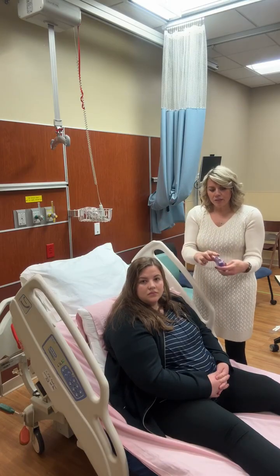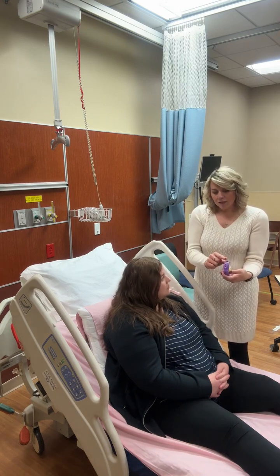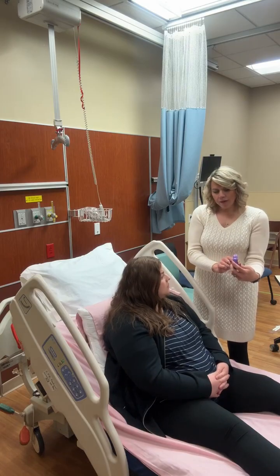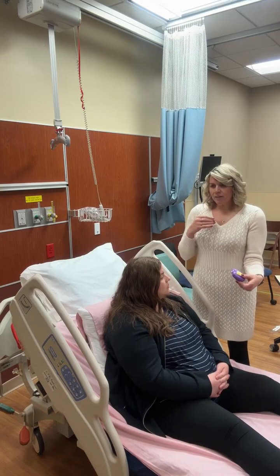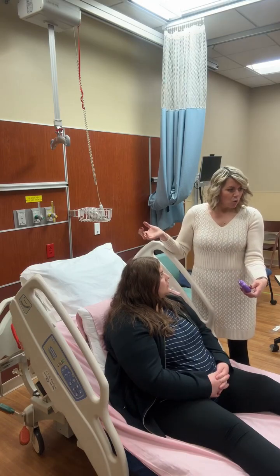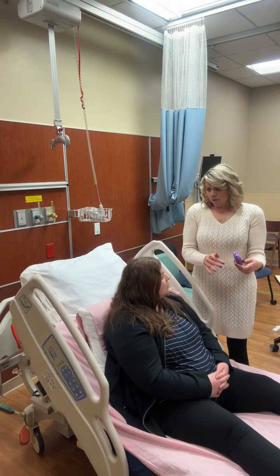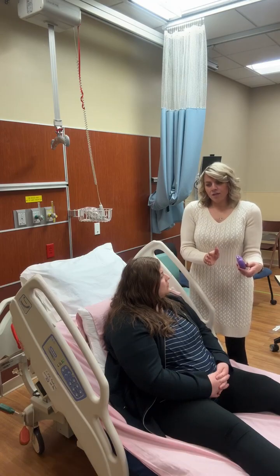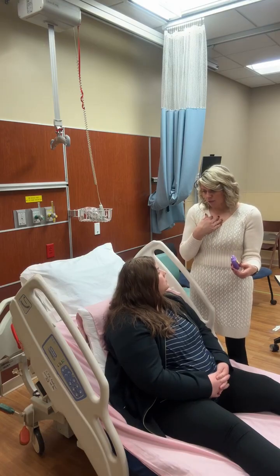So when we do it, we open this up, and then I'm going to tell Ashley, when I pull this down, it's going to puncture a pill in here. And what you're going to do is you're going to put your mouth on here, and you're going to take a deep breath in. It's going to be like this. And you might hear a little flutter noise in here, and that's normal. And then I want you to hold it for about 5 to 10 seconds, as long as you can, really. All right, and then when we get done, we're going to have you rinse your mouth so that you reduce the risk of getting thrush. Okay.